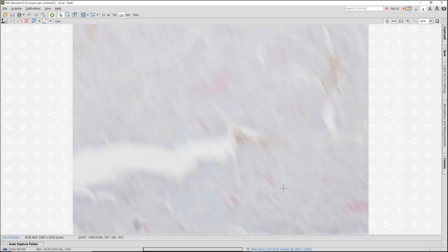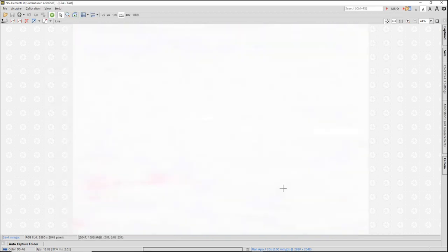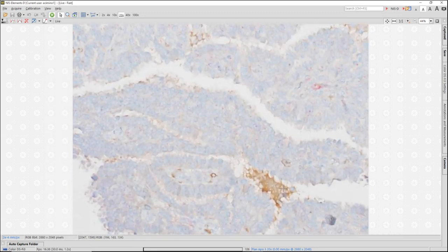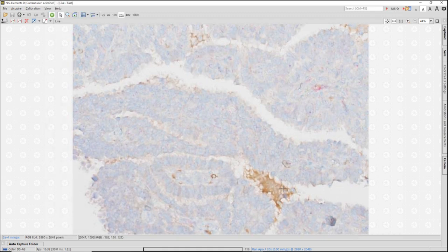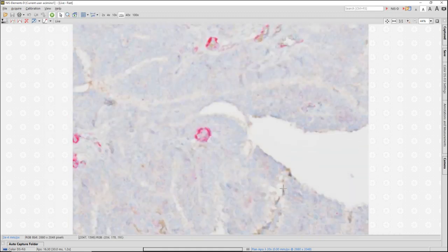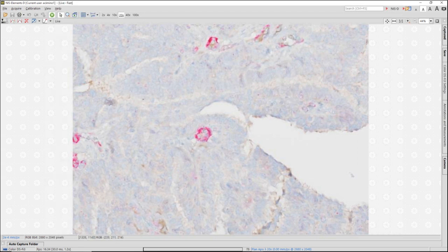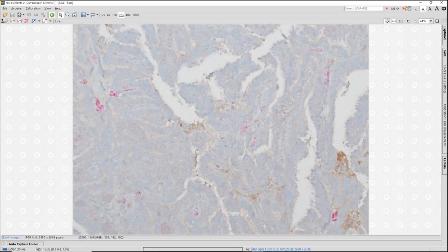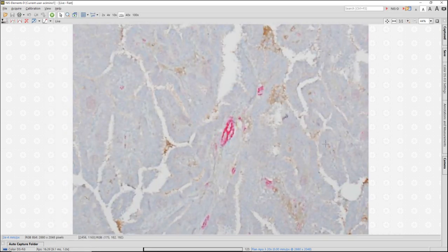Now, I want to bring this again to your attention that this lesion lacks myoepithelial cells. It's negative, right? There are no myoepithelial cells in these cores. What is labeling, though, again, are the capillaries. I know it's a capillary because it's thin-walled. In some areas, they're quite small, little wispy labeling. Sometimes these capillaries become very dilated, and they can push up against the epithelium and may mimic labeling of myoepithelium.